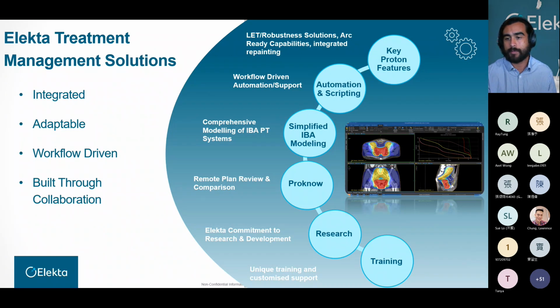And then we have training. We understand that every particle center is very different. Typical radiotherapy centers using Linacs aren't all the same, but particle therapy centers are even more unique. So we provide a very customizable support and training package so that particle therapy customers can not only maximize their hardware, but also maximize the software solutions driving that hardware.